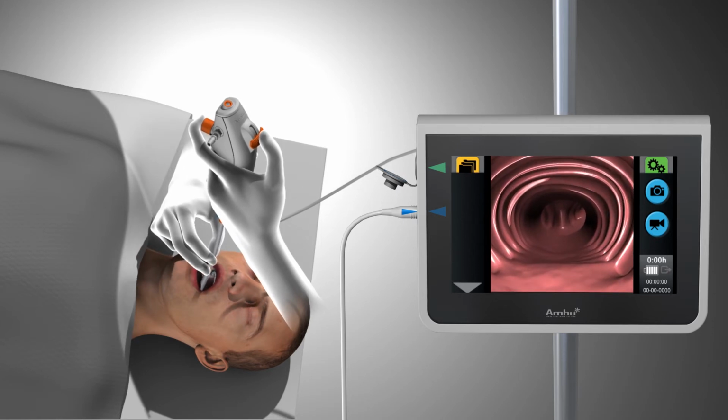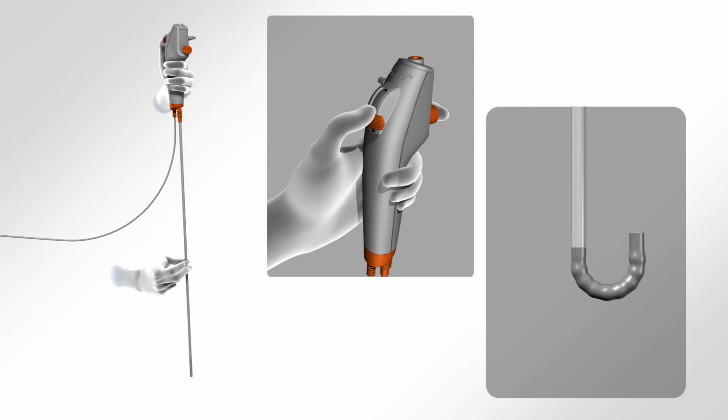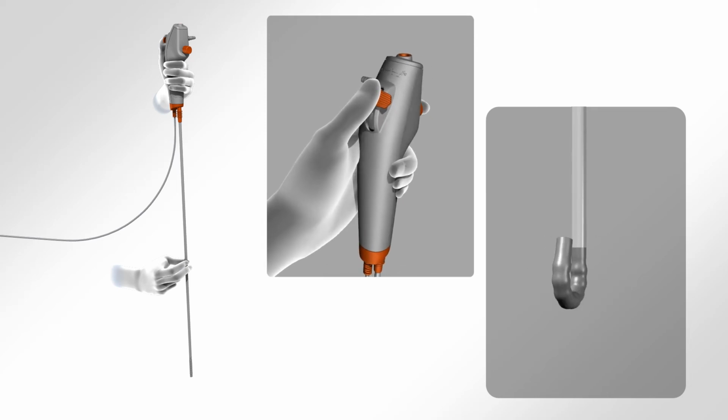When inserting the aScope orally, it is recommended to use an oral airway to protect the aScope from being damaged. Keep the device vertical with the working channel port pointing straight up. Use a thumb to move the control lever and an index finger to operate the suction button. The control lever is used to flex and extend the tip of the aScope in the vertical plane. Moving the control lever downward will make the tip bend anteriorly, and moving it upward will make the tip bend posteriorly. Rotating the handle controls left and right movement.